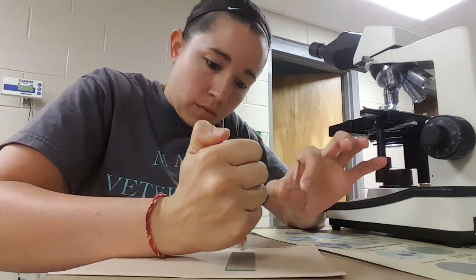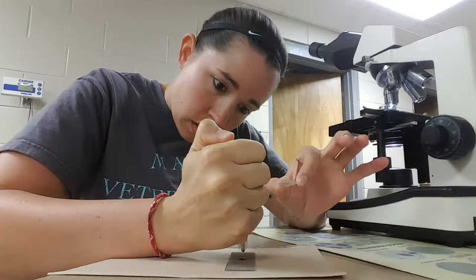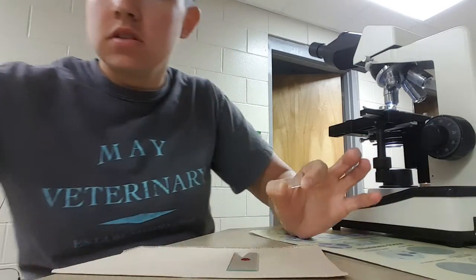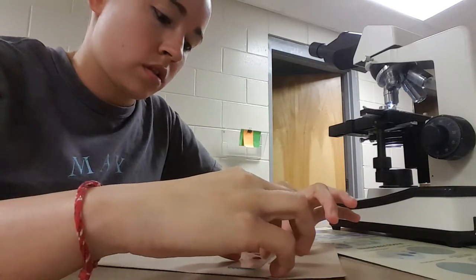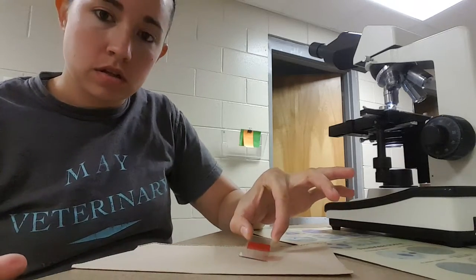So what I'll do is I'll just drop one drop of blood onto my slide, set that aside, and I'll apply my cover slip at an angle and let that spread throughout like that.